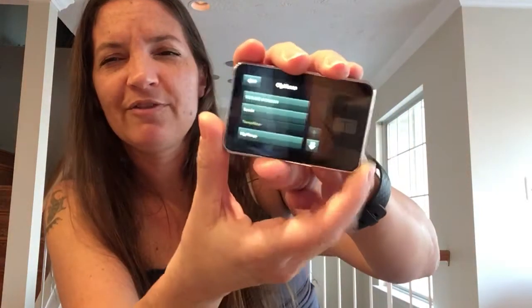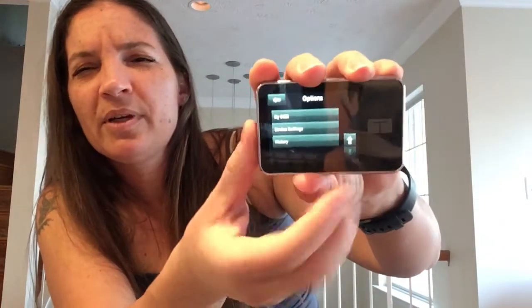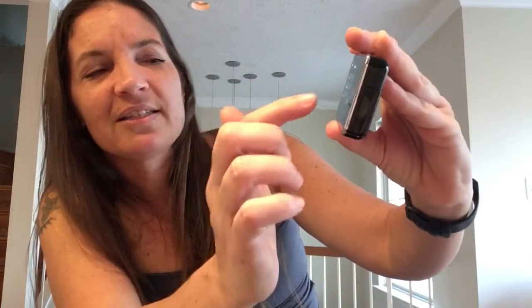We've set up carb ratios. The next thing available in my menu is — basal IQ is different, but I have my pump first, and if I scroll down, I have my CGM, device settings, and then history. My CGM is the next thing under my menu.